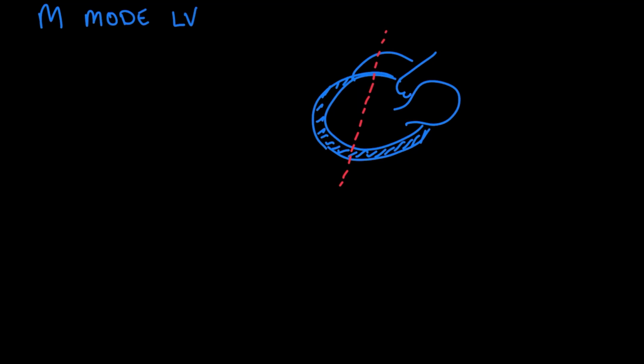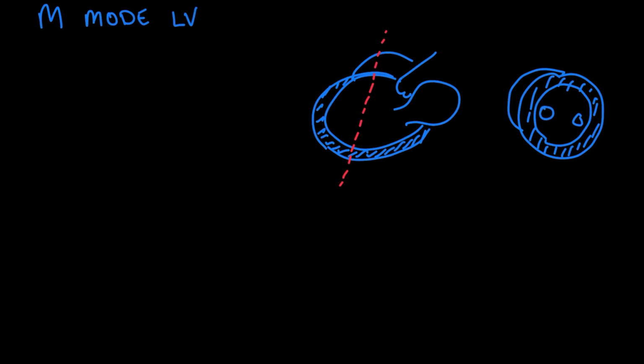And I'll just mention that sometimes this confuses people, but you can also do the same looking at your left ventricle in the parasternal short axis. So we just took our probe on the patient, rotated it 90 degrees, and then we can slice. You might see your papillaries maybe over here and over here, and we're slicing somewhere here, right through. Remember, with M mode the goal is better temporal resolution. We'll say approximately 10 times better temporal resolution than traditional 2D echo.